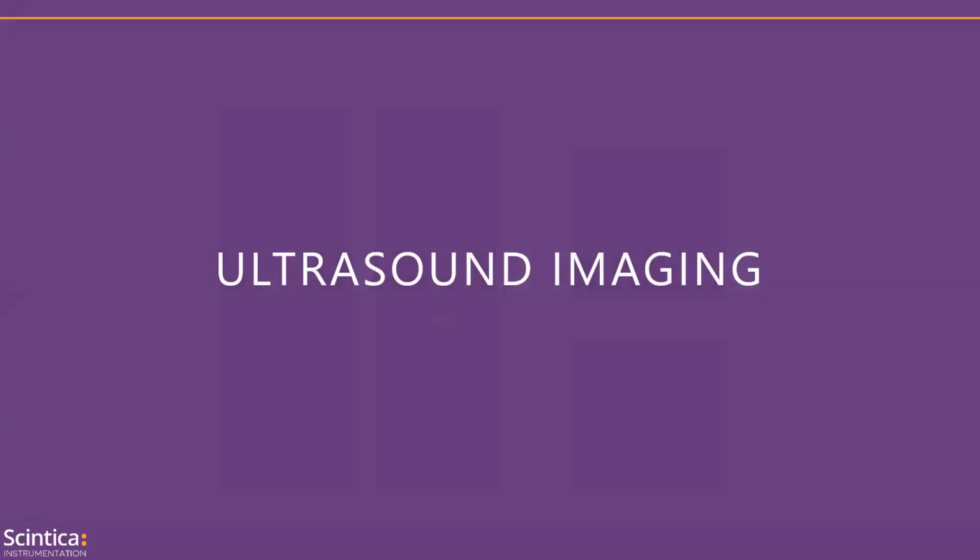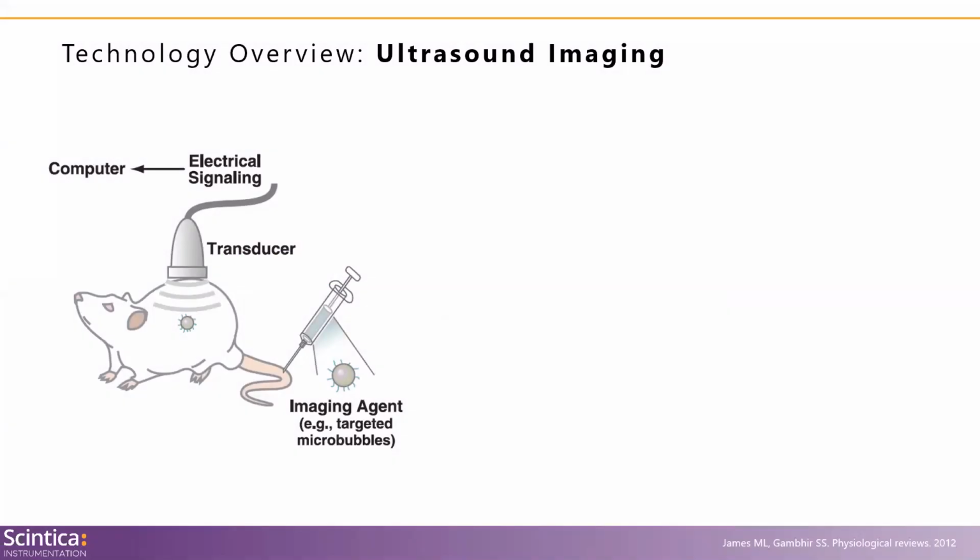Okay, so moving on to ultrasound imaging. So ultrasound is an imaging tool that exploits the properties and behavior of high frequency sound waves as they travel through tissue.